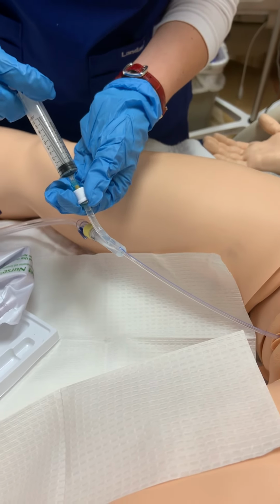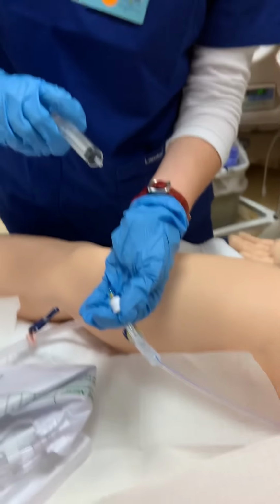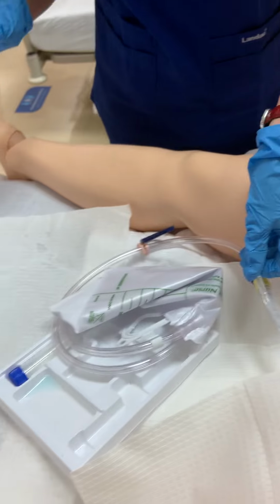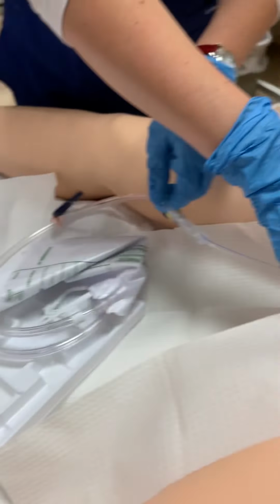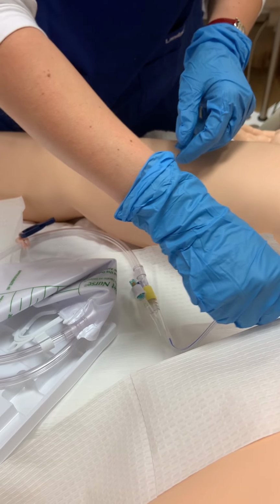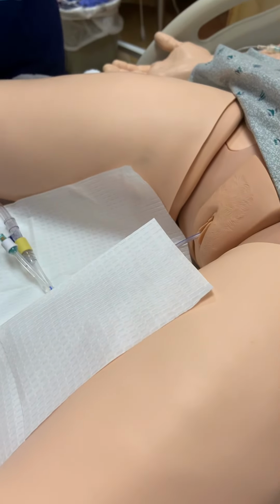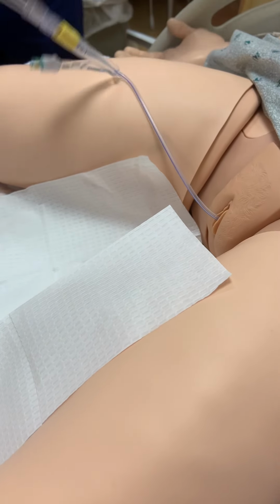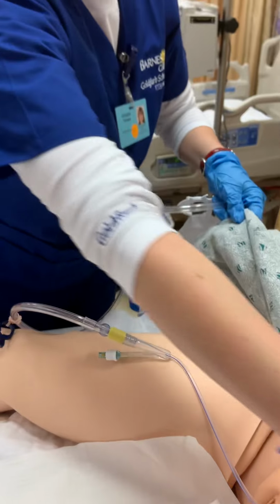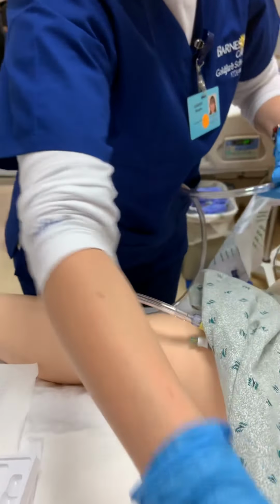Still feeling okay, ma'am? Yes. Okay, great. Thank you for asking. Okay. Just a little tug to make sure that the balloon inflated, and it did. I'm not feeling that it can come out in any way. So at this point, let me just cover you up a little bit. Get you a little bit of privacy.